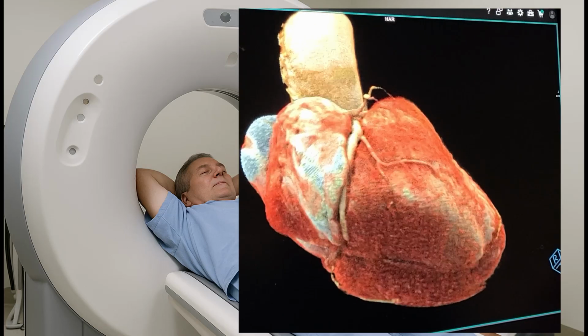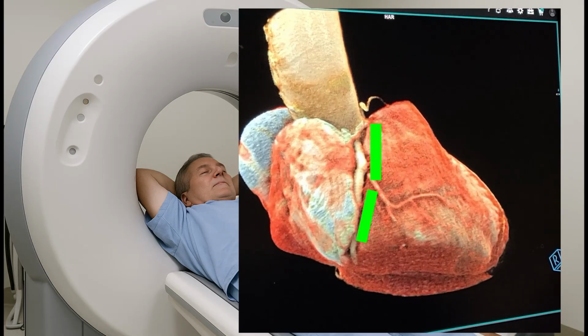Now that's actually 5 stents. 3 stents back to back because they didn't have one long enough to cover the entire distance, which was 84 millimeters or 3.3 inches. And then 2 more stents inserted inside of those stents a year later because the original stents got plugged up with scar tissue. And I was told it's probably because the first set wasn't fully expanded and too narrow to start with. The doctor that inserted the second set inside of the first set made sure to fully expand the second set to help prevent that issue in the future.